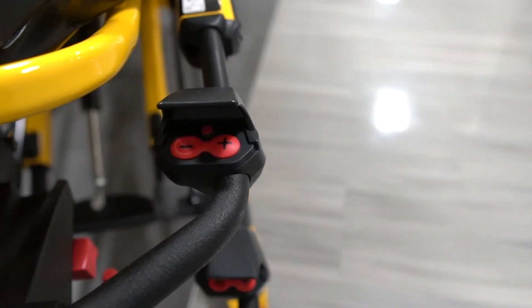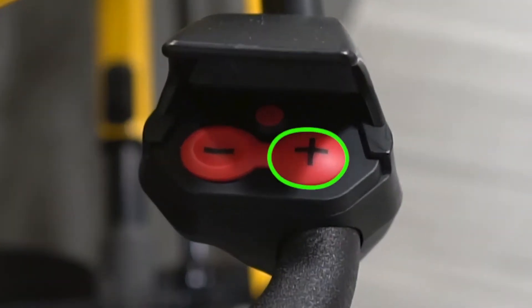These are the adjustment controls of the Stryker. To raise, just press and hold the plus button, and to lower, press and hold the minus button.